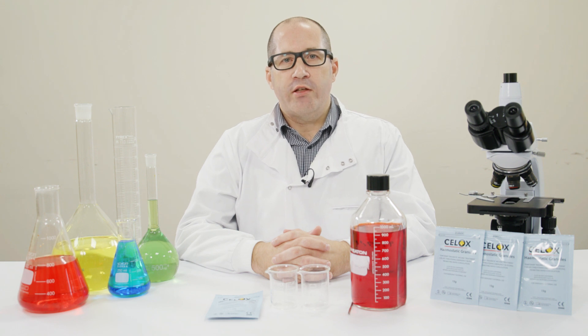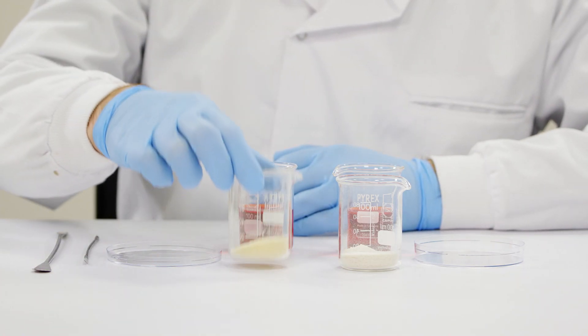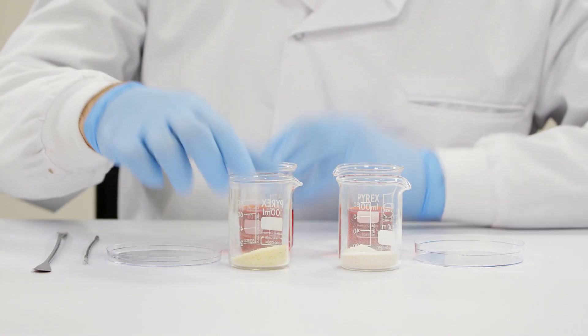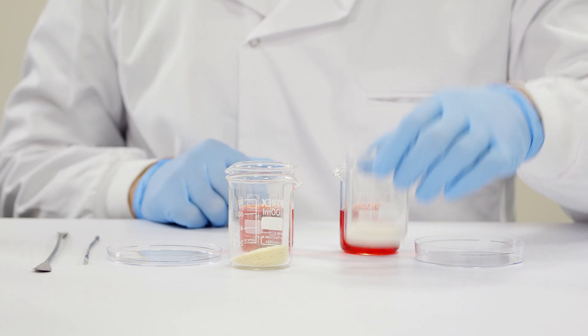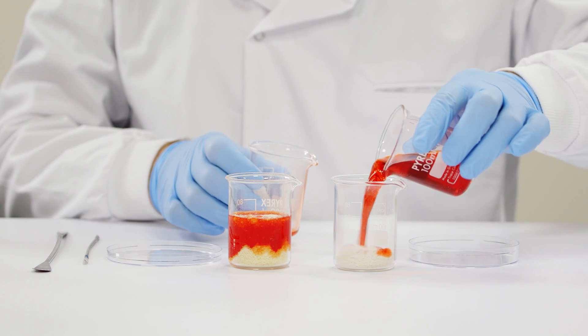To show you how CELOX granules work we are going to use blood-like fluid. Also, to help clear some misconceptions, we will run the same test with pure chitosan flakes and demonstrate the difference. We have added CELOX granules to beaker 1 and pure chitosan to beaker 2. Next I'm going to add the blood-like fluid into each of the beakers and stir them up.